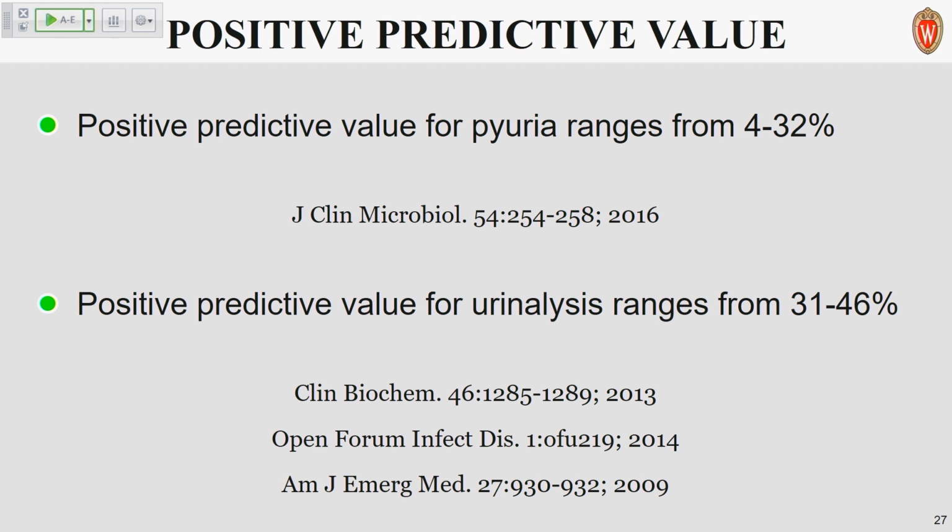So it's not gospel that this person's going to lead to a significant urine culture finding. And in general, if you add other analytes, such as your nitrite result, overall the predictive value is probably less than 50% in some literature, right?